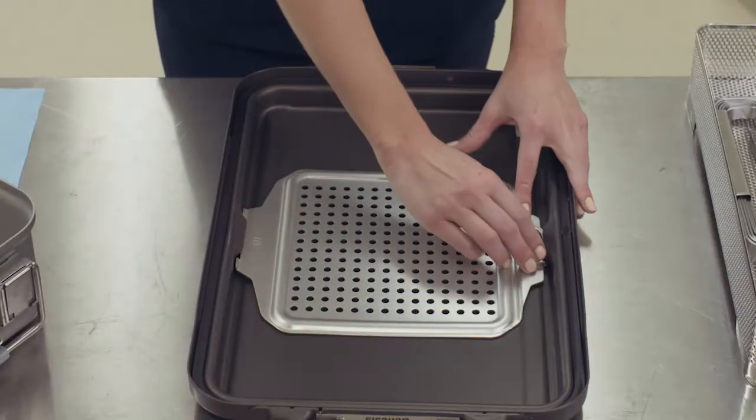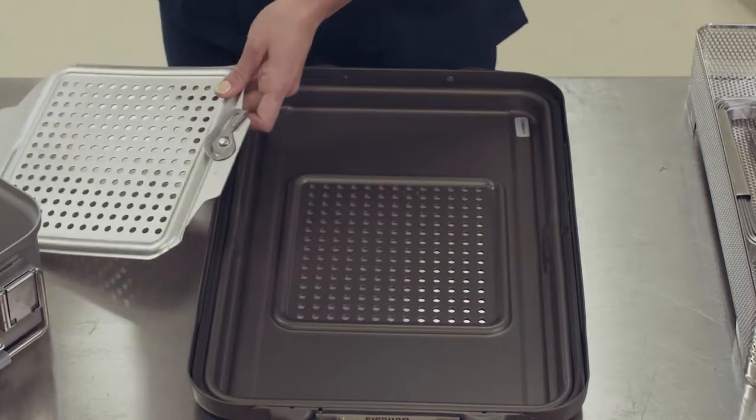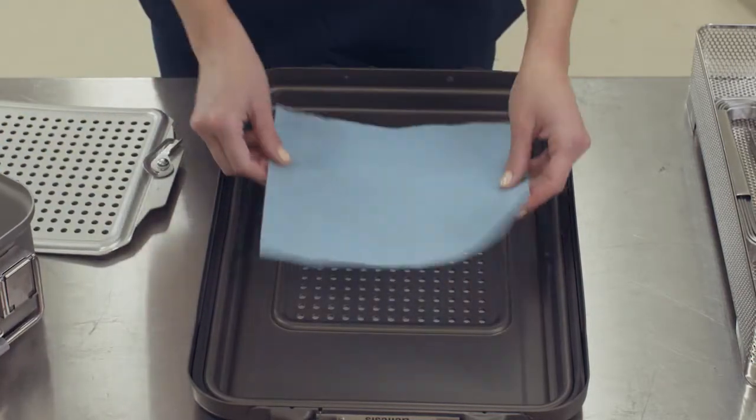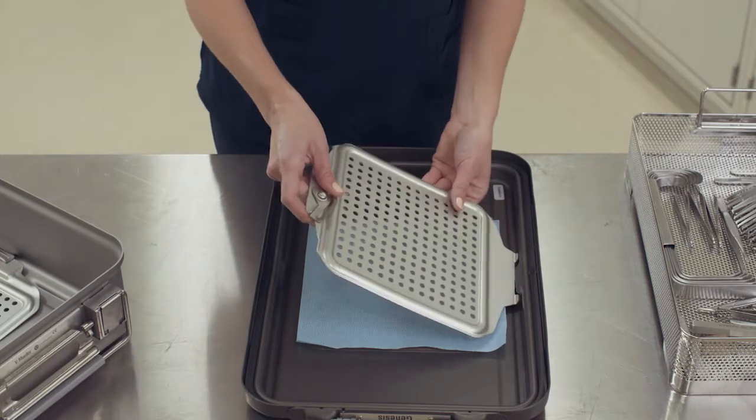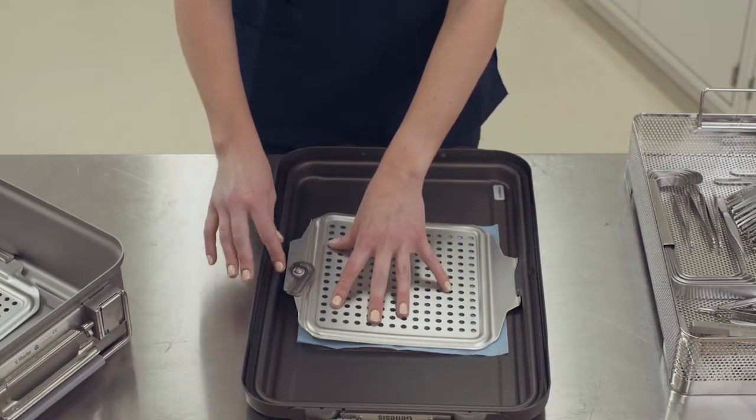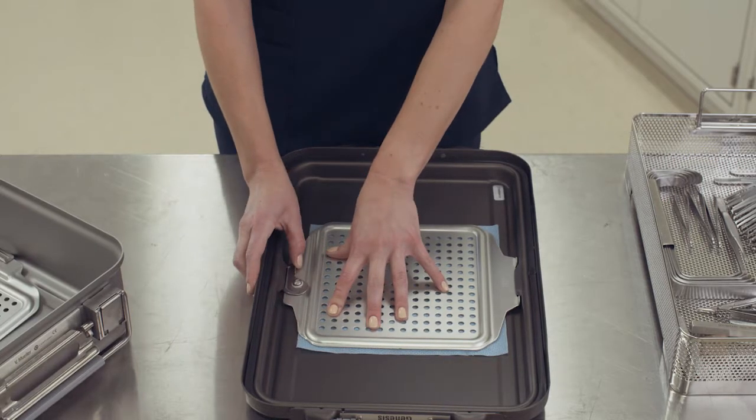If the optional protective plate is not used in the lid, place a new filter directly over the perforations. As was done in the container lid, place the retention plate on top of the filter. Apply downward pressure to the plate and simultaneously rotate the lever toward the side of the container. Make sure the lever is rotated completely and the retention plate is locked firmly in place.